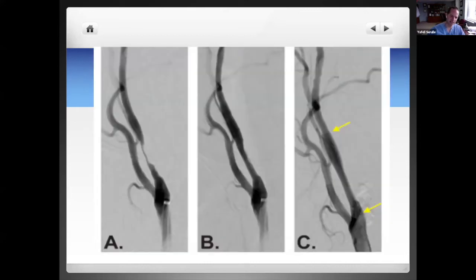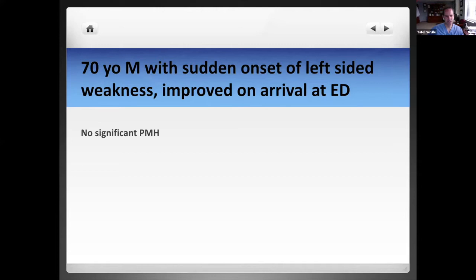And this is the classic case of a stent, another carotid artery here, showing an area of significant narrowing. And then this is the post-stenting. We can put a stent from this segment to this segment and then cure that narrowing. Very safe procedure when done the right way, and has a lot of potential positive impact in a patient.